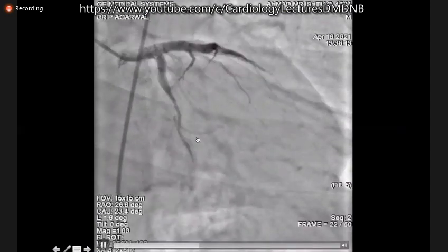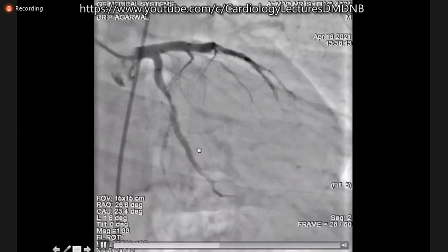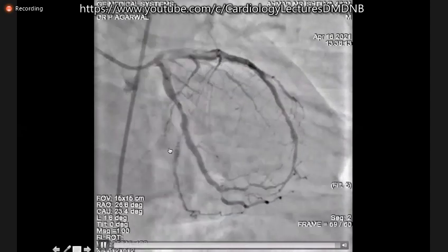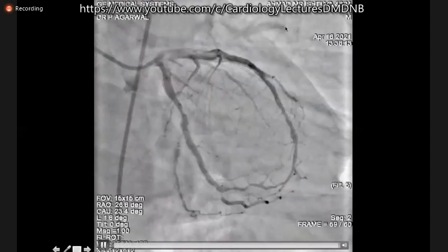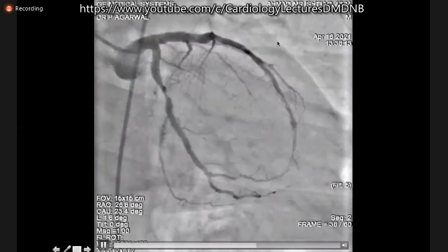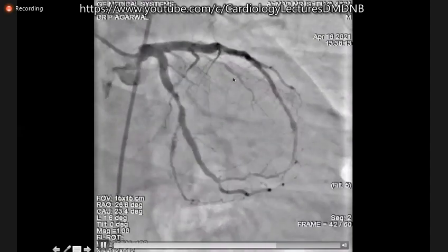His RCA is unremarkable. You see, in the circumflex, whosoever did the job, they put in a bifurcated stent where the smaller branch of the stent is closed off. That does not mean much to me. The main stent in the circumflex is flowing fine. And if we just have a look, the LAD stent is doing reasonably well. This is which is here. It's a 4.0 stent, doing fine.